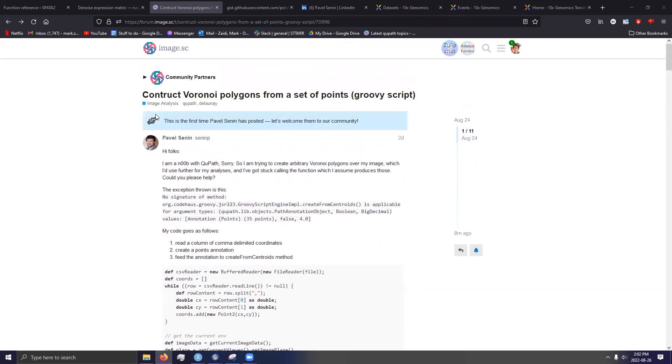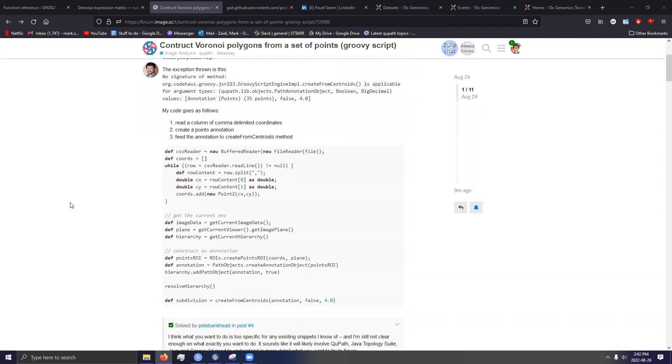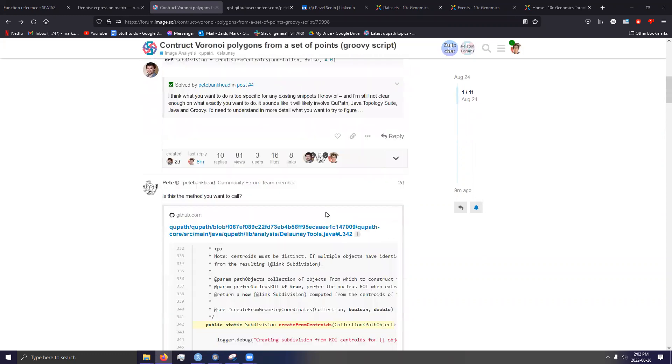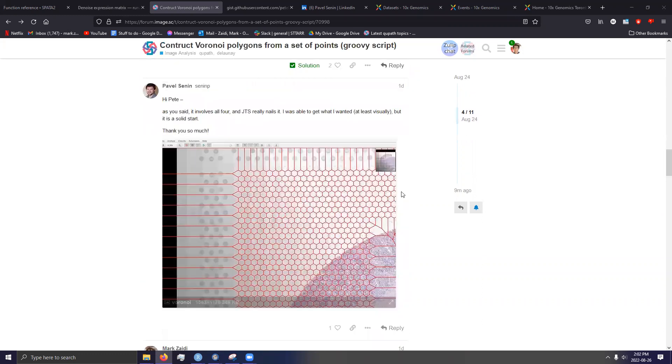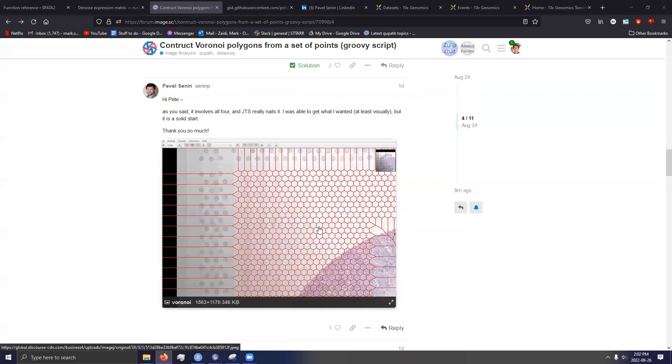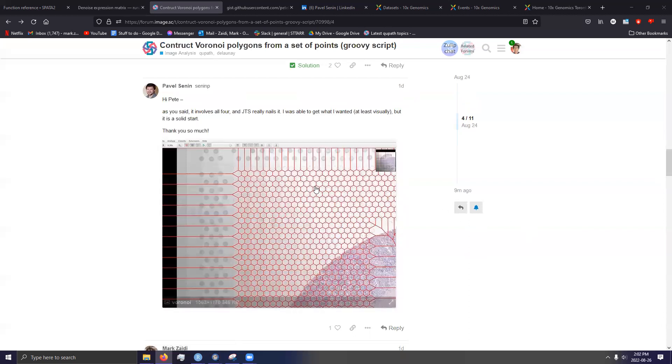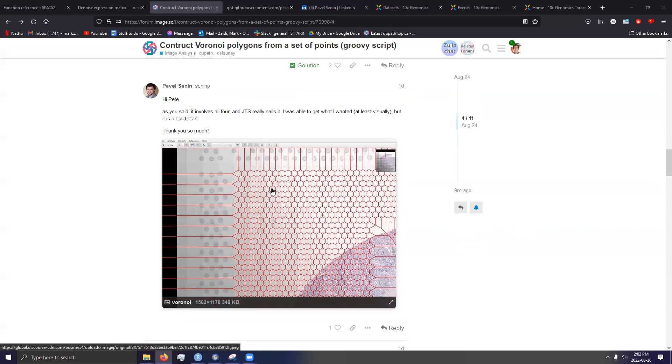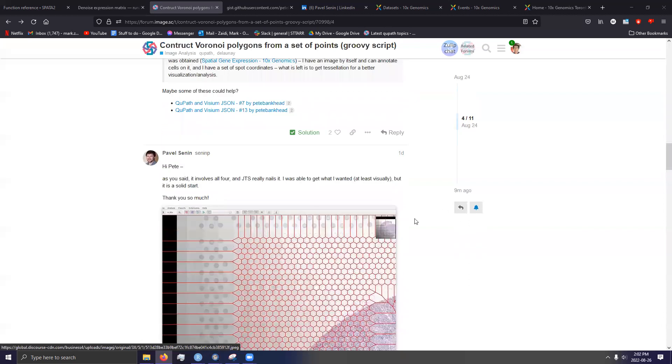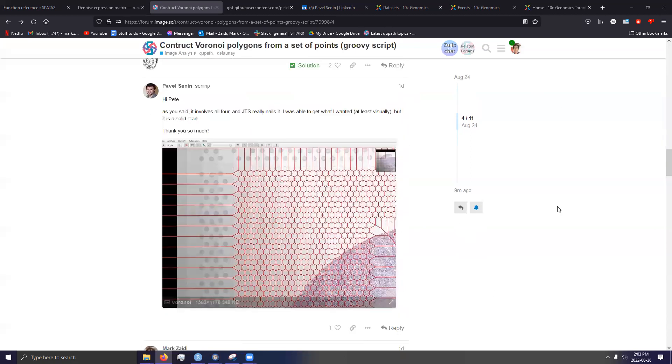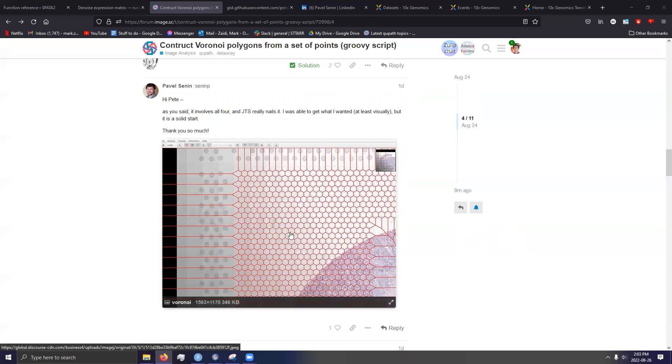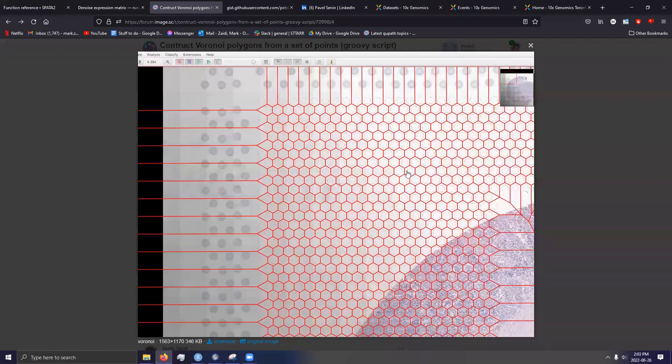Now, this forum poster, Pathol, and actually, despite calling himself a noob, has done an amazing job implementing Voronoi tessellations in Visium HE images. So what this essentially does is if you provide a list of coordinates for where the Visium spots should be located, you can then dilate these spots until you reach the border of another spot. And by having a Voronoi tessellation of a staggered grid of points, you essentially have these hexagonal like structures.